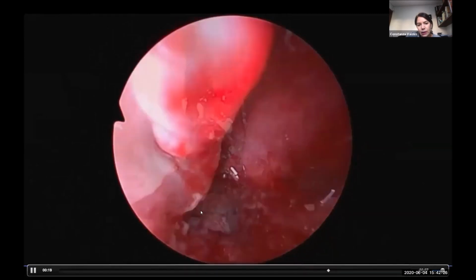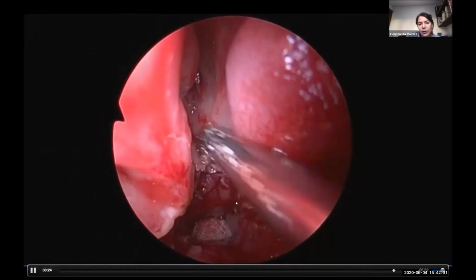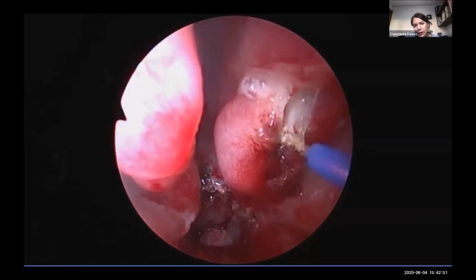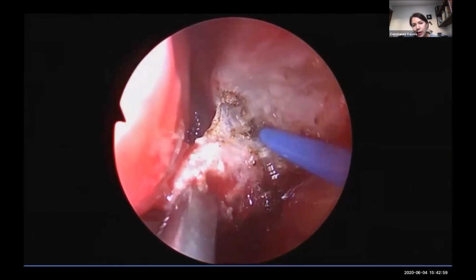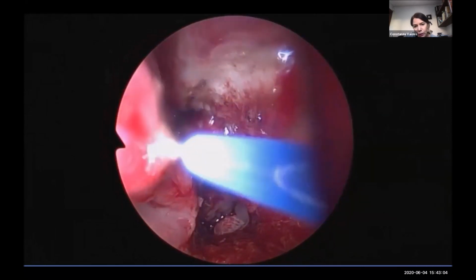Now this is only tissue that we are getting out. We have the new choana here, and we have to cover this tissue. If not, the same thing is going to happen. And as in rhinology, we know other flaps, like the inferior turbinate flap, which is very important for skull base, and we can also use it for this. The middle turbinate flap is also useful for covering the lateral walls of the nose. So what we did in this patient was a middle turbinate flap bilaterally, and we flipped it over so we could cover the lateral parts of the neochoana, so it doesn't restenose again.